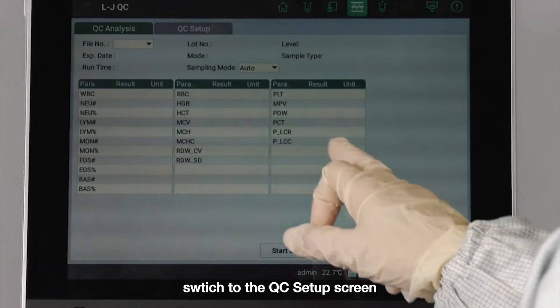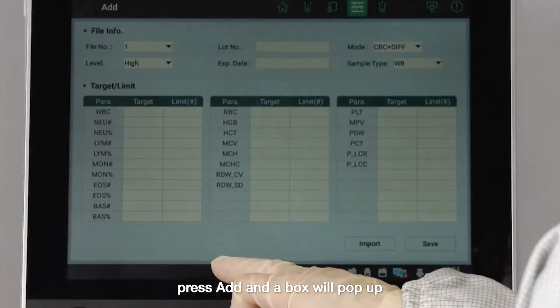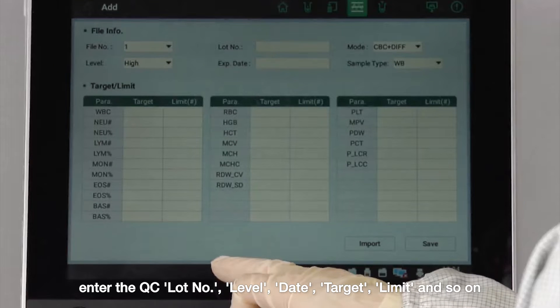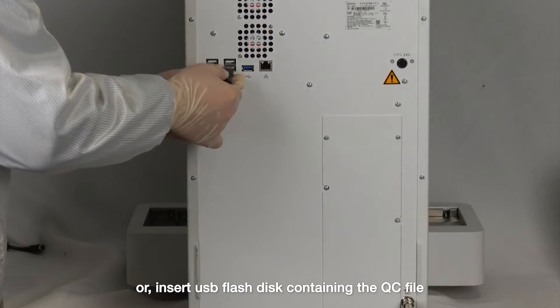Switch to the Quality Control Setup screen. Press Add and a box will pop up. Enter the Quality Control lot number, level, date, target, limit, and so on.